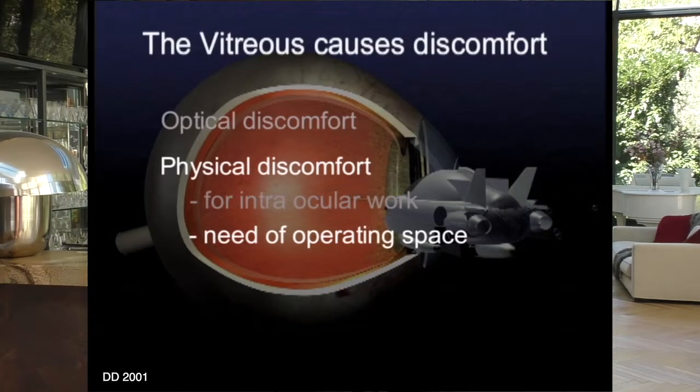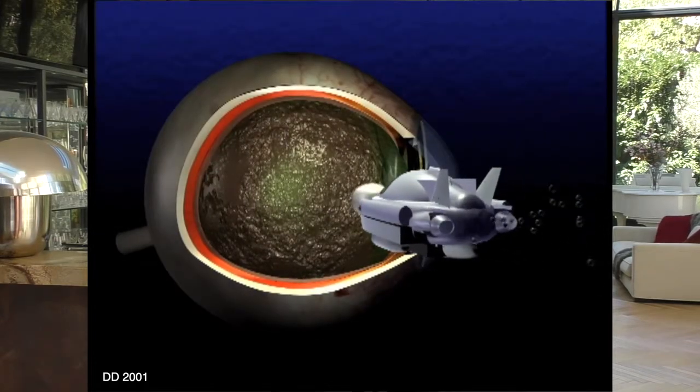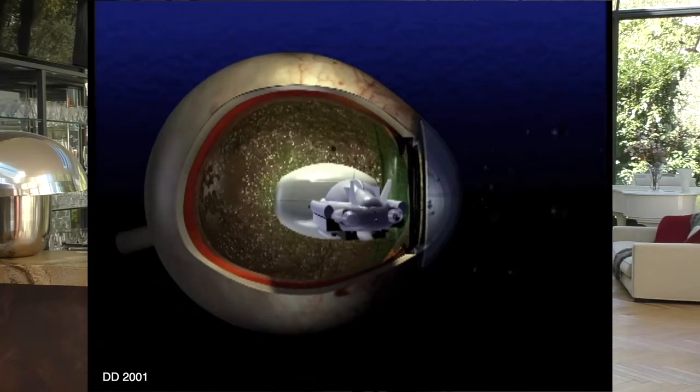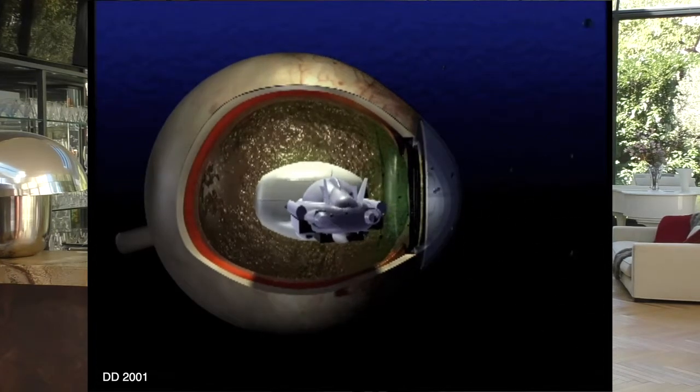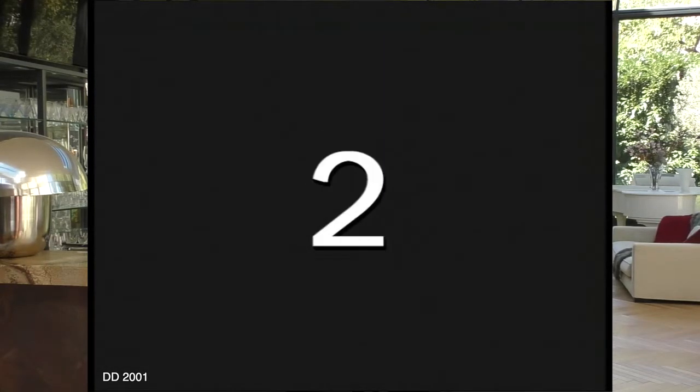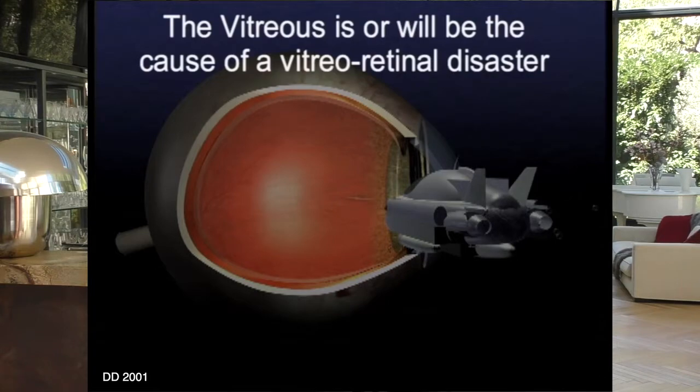Or because we need operating space for a very important buckling, for a gas bubble, or for a PFCL or silicone oil injection. Second, the vitreous is or will be the cause of a vitreoretinal disaster.